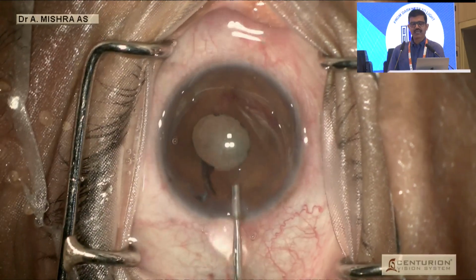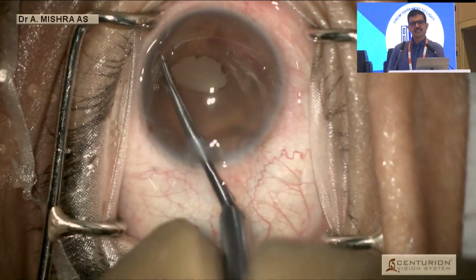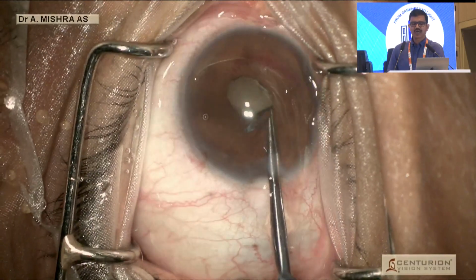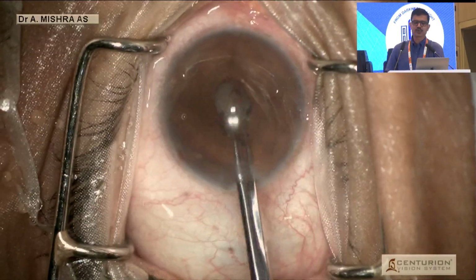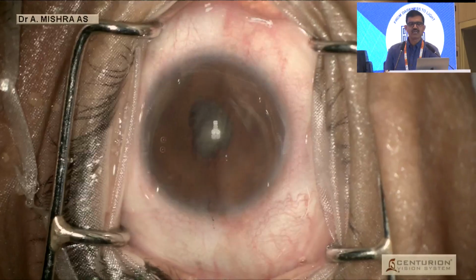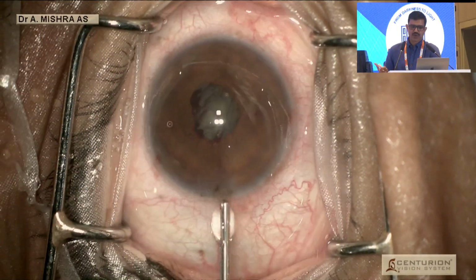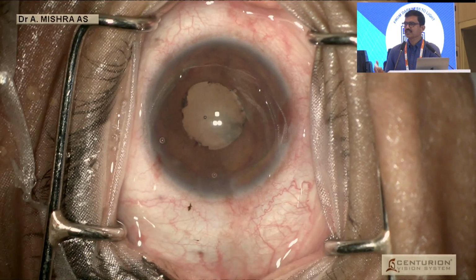So you know that we have severed it on one end. Then we go in, inject some viscoelastic. Then we try to tug again, tangential force, right opposite. You have to take care that the iris does not put too much stress at the root, because then the ciliary body will start bleeding and it causes a disturbing hyphema. Ultimately, it comes off. In this patient, after dilatation, the pupil expands to sufficient size. Then it is your choice whether or not you want to put in a pupil expansion device.